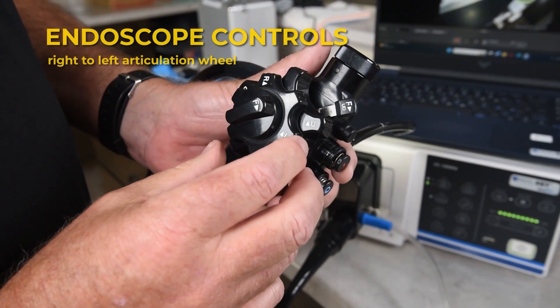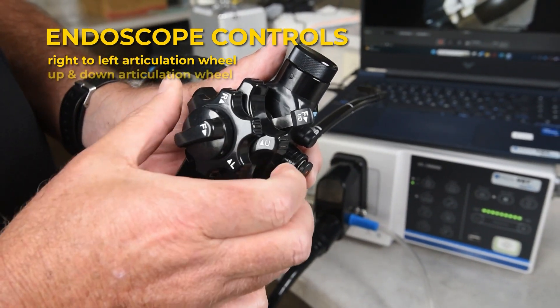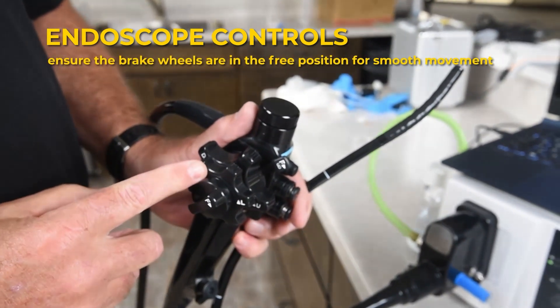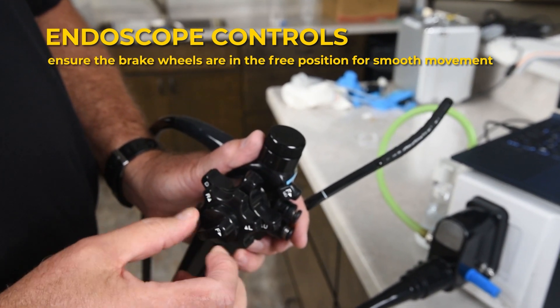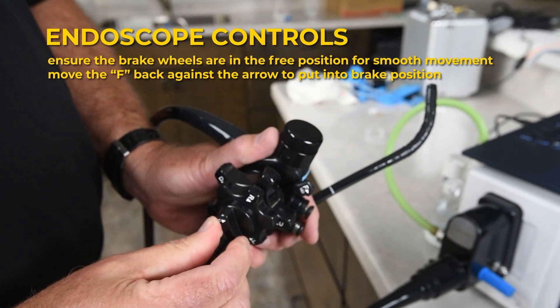To control the endoscope's articulation, use the right-to-left articulation wheel and the up-and-down articulation wheel. Ensure the brake wheels are in the free position for smooth movement. The F on the right-to-left wheel brake stands for free. To put it in the brake position, move the F back against the arrow.